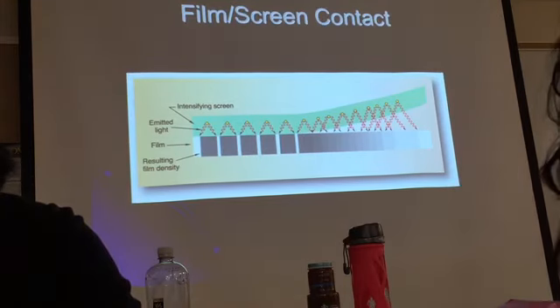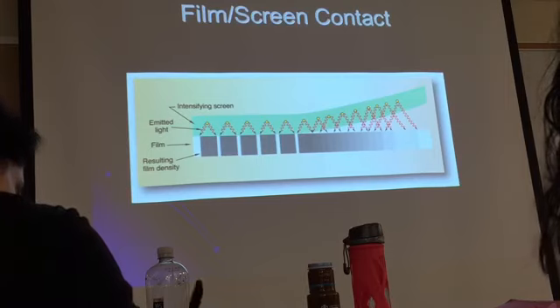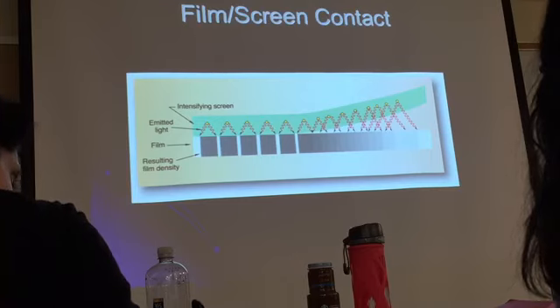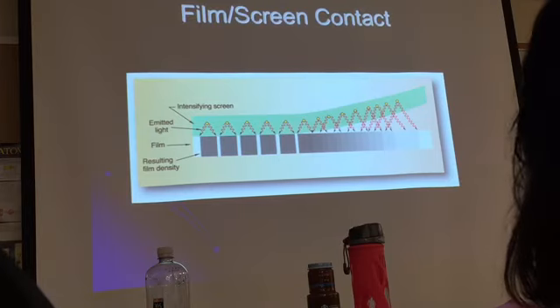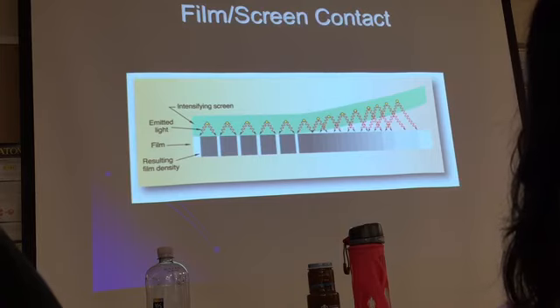So it was not a good idea, for example, people, once again, you guys are not working with this, but if you work with this type of system, if you're going to be working with film, it is important not to sit on it. Okay, people sometimes sat on it. What do you think you got on the screen? A button. Right there. Yeah, people sat on it. I'm serious.